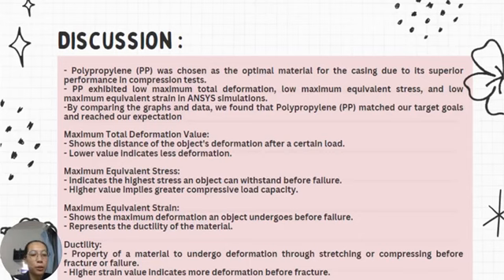We will continue part 2 discussion. Polypropylene was chosen as an optimal material for the casing due to its superior performance in compression tests. PP exhibited low maximum total deformation, low maximum equivalent stress, and low maximum equivalent strain in ANSYS simulation. By comparing the graph and data, we found that polypropylene matched our target goals and reached our expectation.